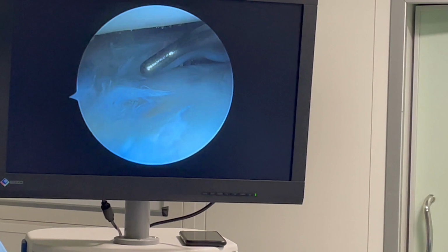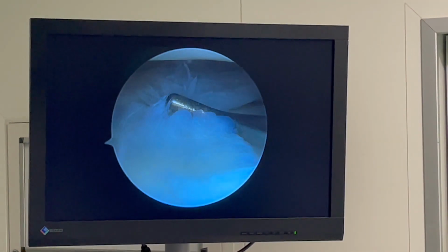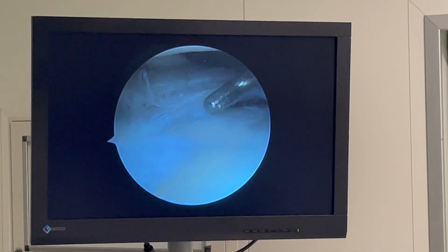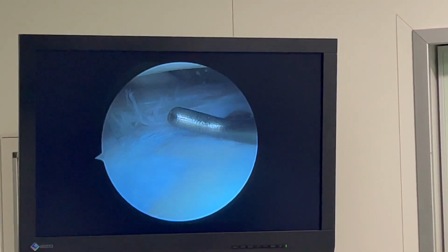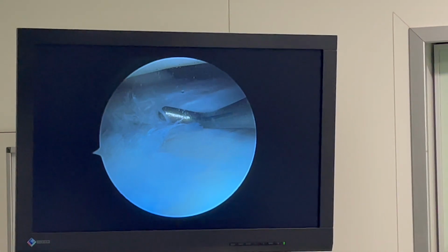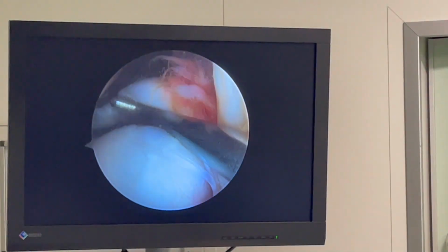Yes. This part is not going to affect you at all, right? This is just 1 or 2 millimeter part. I mean, in the picture you will see it's a huge one, right? But it is a magnified view. Right? Now this probe is like 2 millimeter, the bent part. So it's approximately 1 to 2 millimeter part is broken. Right? We'll just trim it off. So that's what we are going to do.